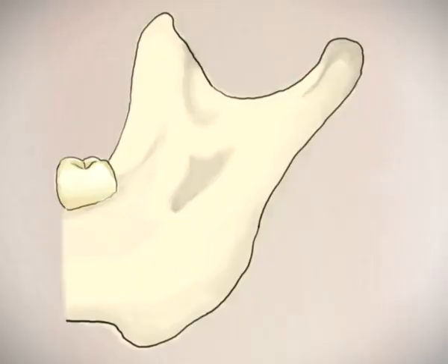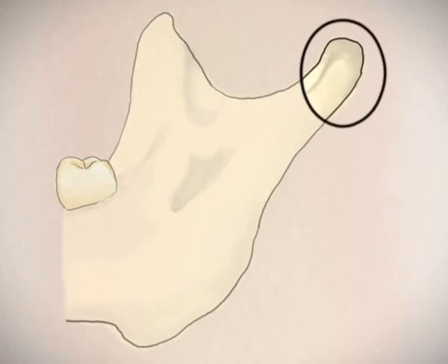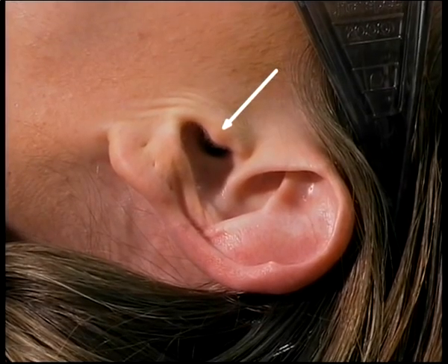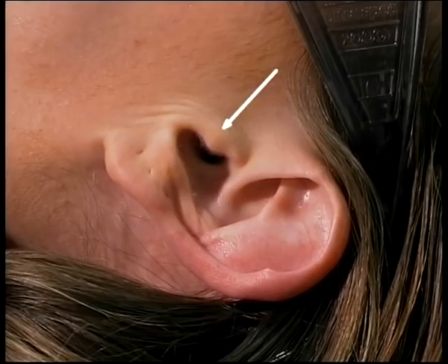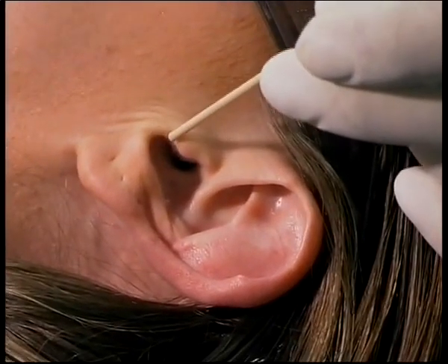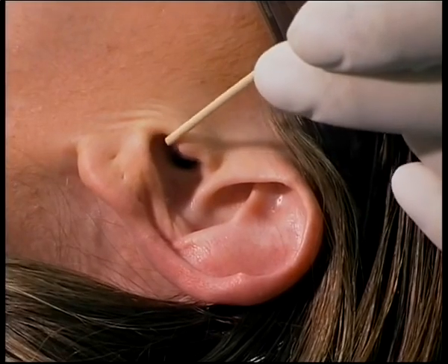The Gow-Gates mandibular block is a high mandibular block. We're depositing local anesthetic at the neck of the mandibular condyle. The tragus is the equivalent of the head of the mandibular condyle. Just below the tragus is the intertragic notch. This is the equivalent of the neck of the mandibular condyle.